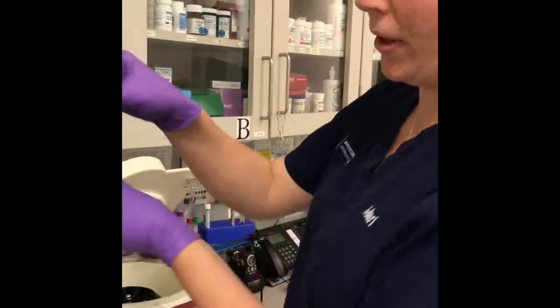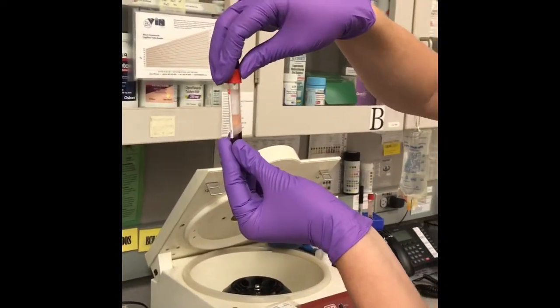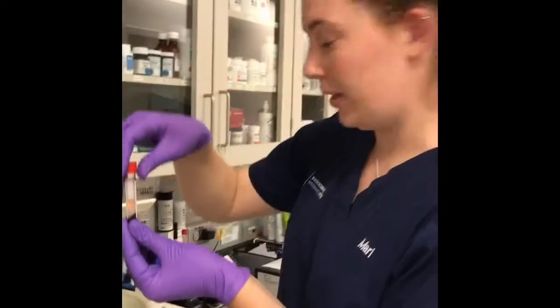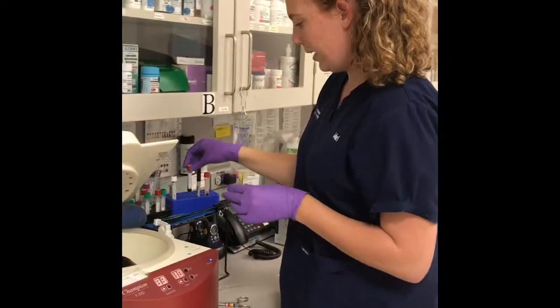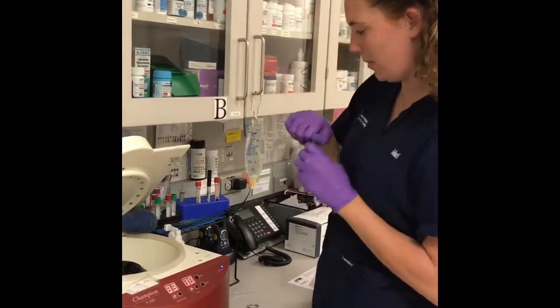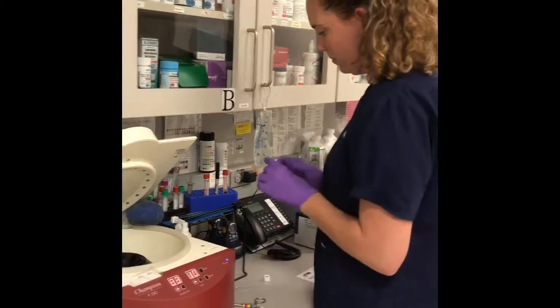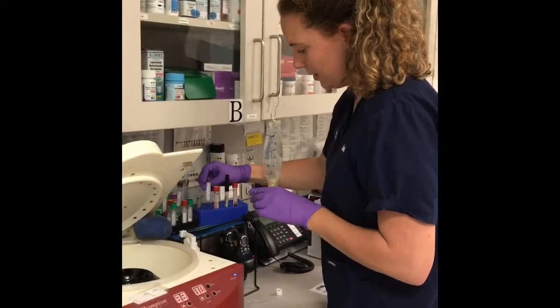And our serum separator tube, once again, some very mild hemolysis. Doesn't appear to be lipemic. Overall, a very clean sample. We'll go ahead and harvest our serum into our plain no additive top. So I'm just going to open that and set it in our rack.